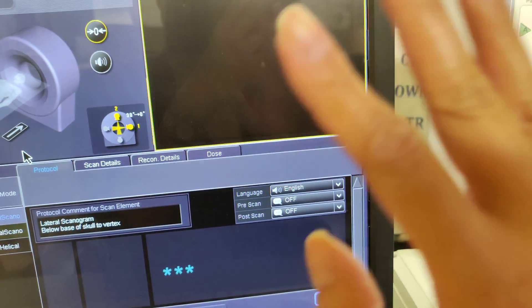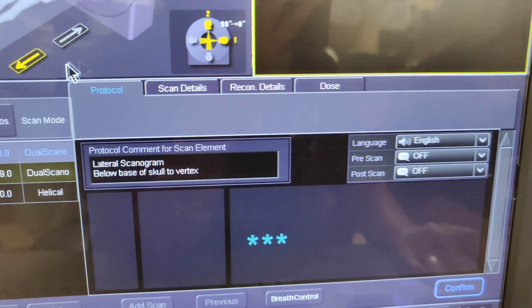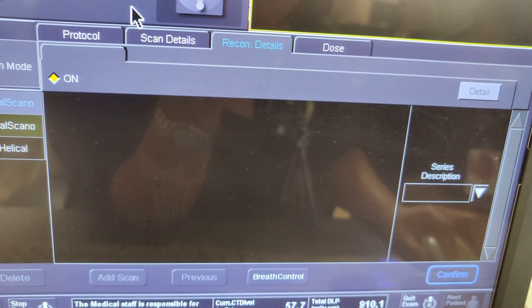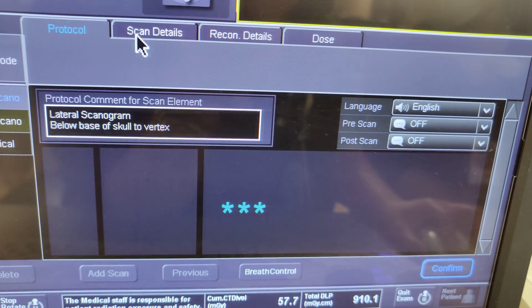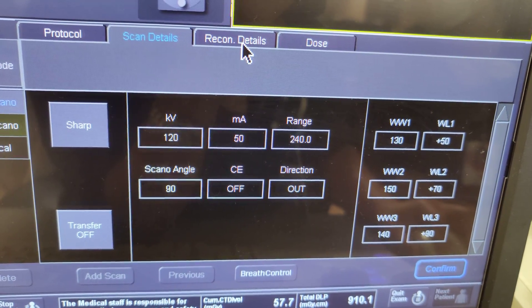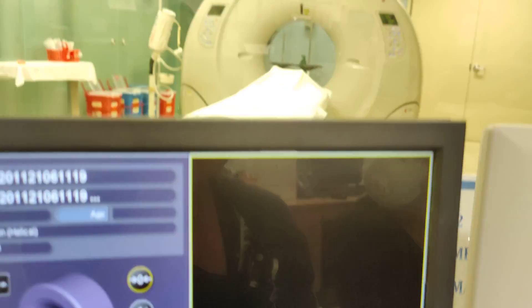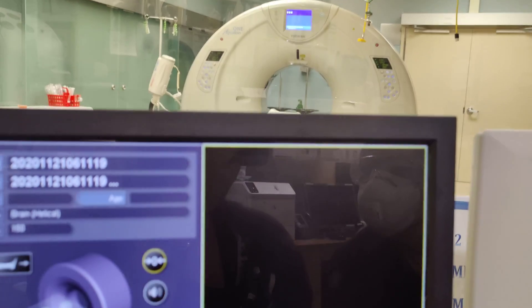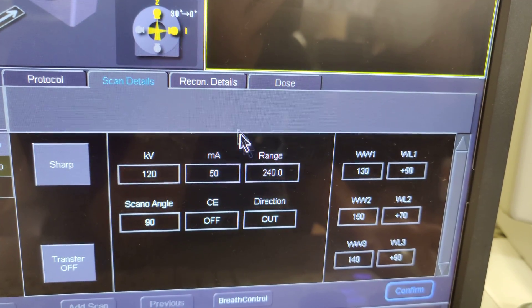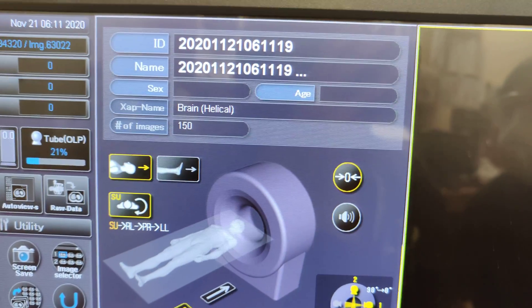We're going to go through how the CT machine works. The question is how do you manage rotation time? This is a Toshiba scanner — a 320-slice machine. We're in a head scan right now.